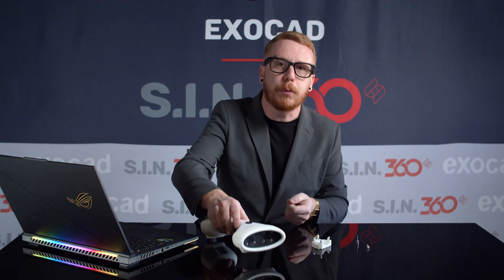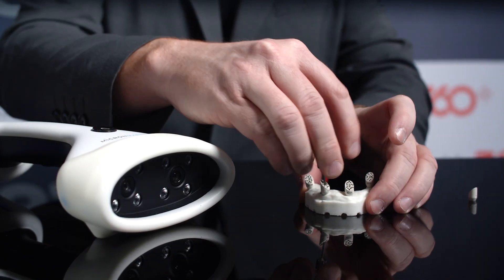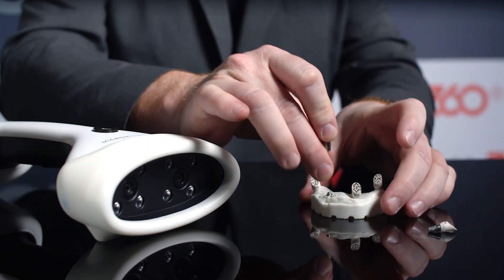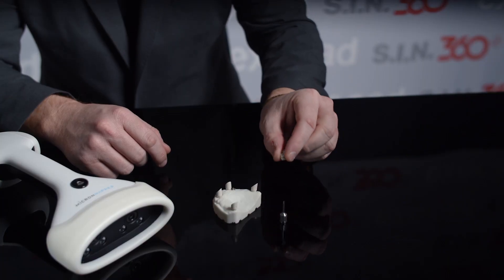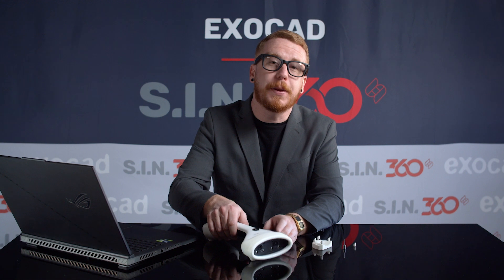Next, we will place the camera down, remove the scan body from implant site number 10, and grab a new scan body for implant position 11. It's important to note that you can't move the scan body from implant number 10 to 11 — you must grab a new scan body.